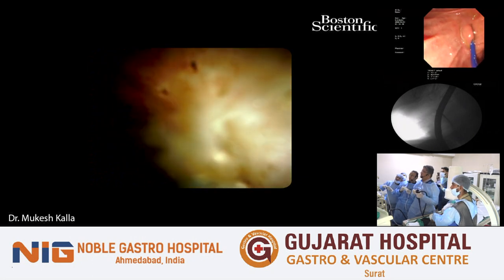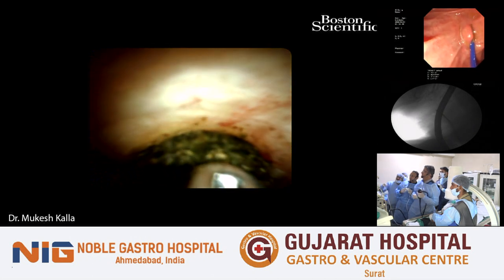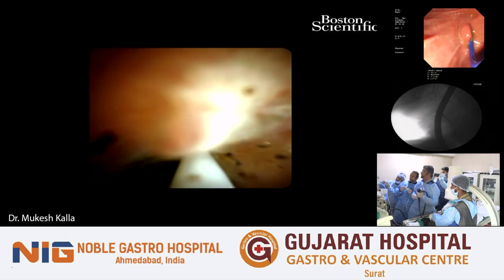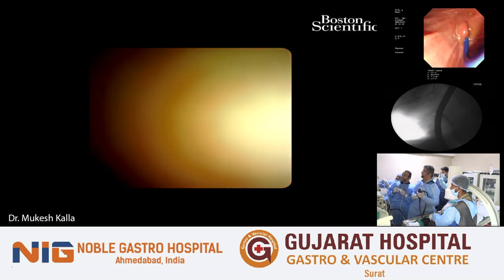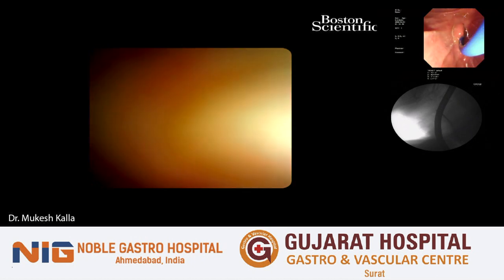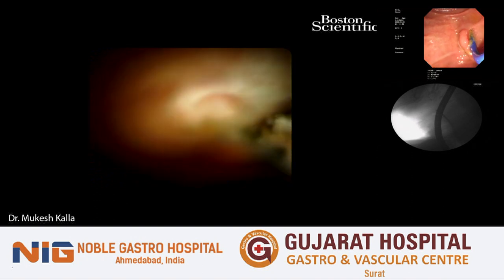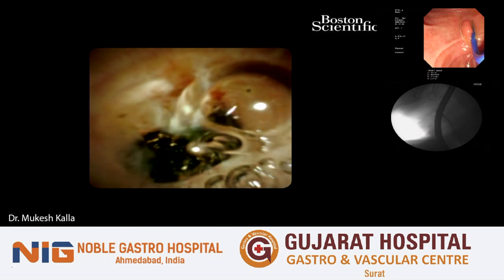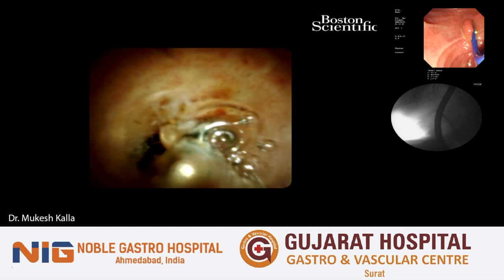These are small movements. If you have to travel straight in the common bile duct, instead of using the shaft of the scope, my suggestion would be to use the up and down knob and to move in and out. I think we don't have enough space to go beyond. So let's go beyond this and then we'll come back, and on the way back we'll get it out. So what I am doing, I am not holding the shaft at all, I am just using the up and down knob. This is very interesting.